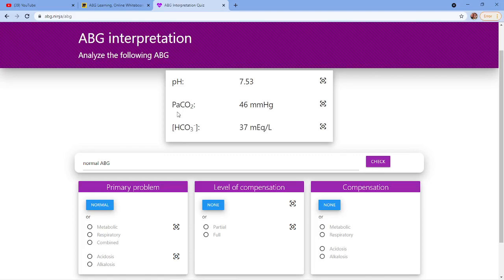Next thing we're going to move on to is the PCO2, or the carbon dioxide amount in the blood. Again, we're going to use a little cheat here, and we're going to know that the normal range for your PCO2 is 35 to 45. Now, we know that CO2 is generated by the lungs; when it converts, it brings in oxygen and lets out CO2 in the lungs. So we know this is the lung factor. And we know that the CO2 is a little elevated in this, but not terrible. It's a little bit, but not terrible.